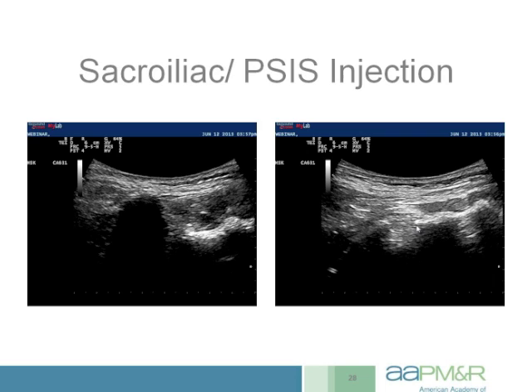and I think you may remember this picture from a little bit earlier in the presentation. This is the ilium, this is the sacrum, again in an axial plane, looking at it from a posterior perspective. Here's the sacroiliac joint here. This is actually a sacral foramen here, and the spine of the sacrum would be over here.